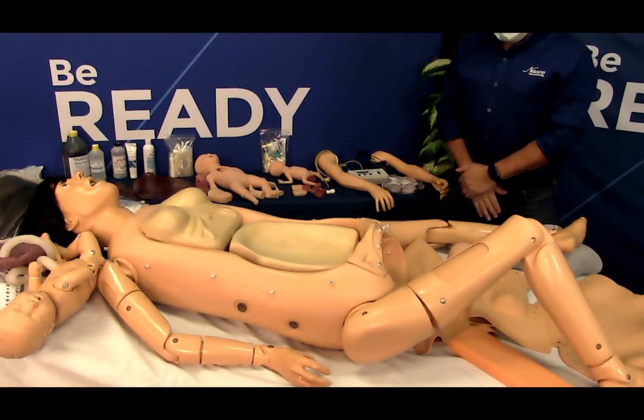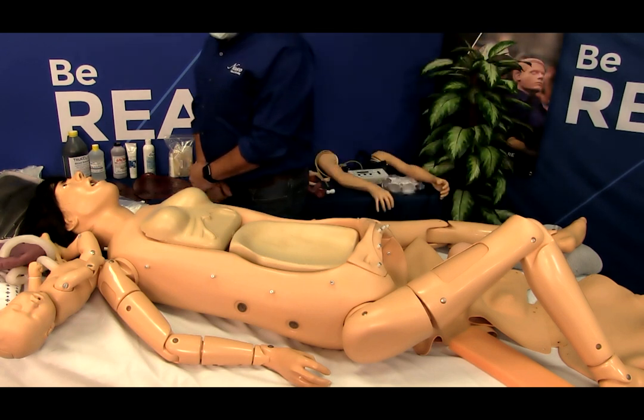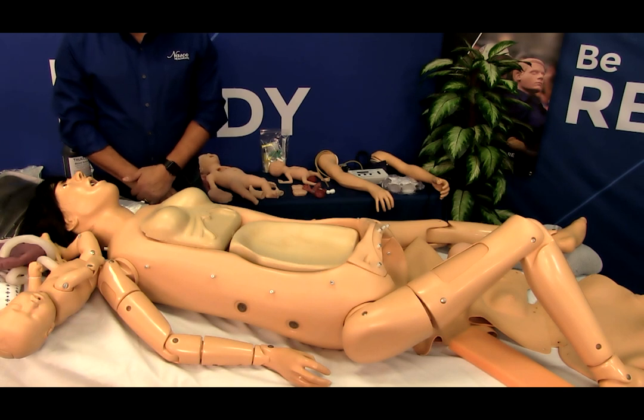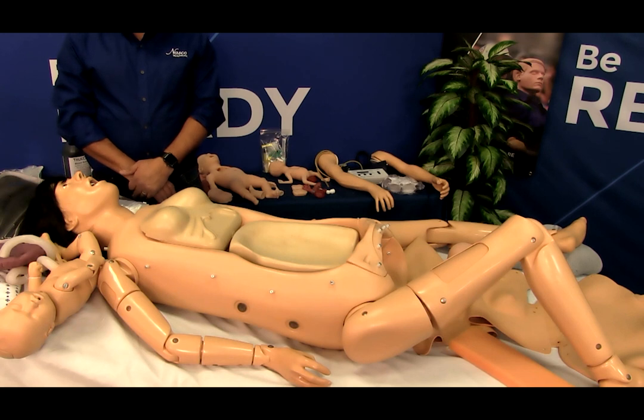This is an instruction video for the Lucy maternal and neonatal birthing simulators. We will be covering the basic, complete, and advanced simulators. The quality and simple design make this simulator easy to use and care for while teaching a variety of patient care techniques. Lucy is a lightweight, full body female simulator that is 66 inches or 167 centimeters long and weighs 35 pounds or 16 kilograms.